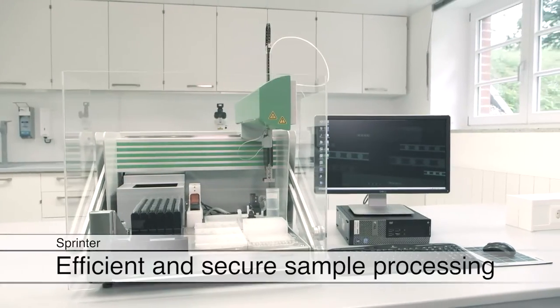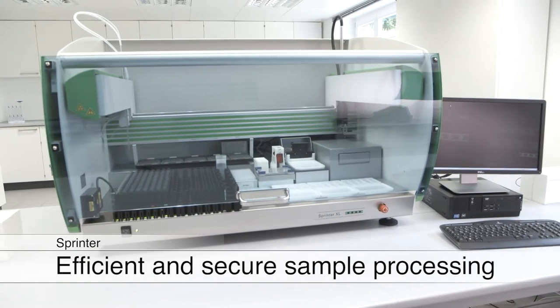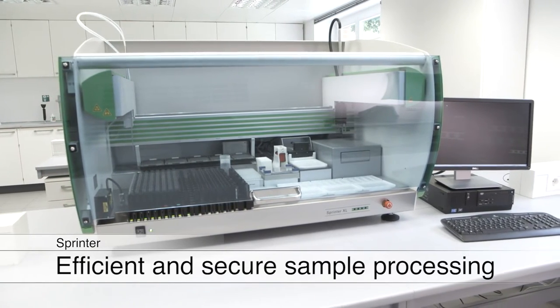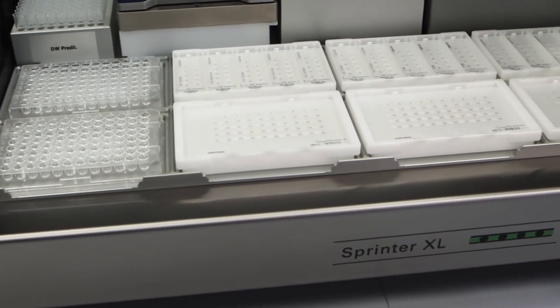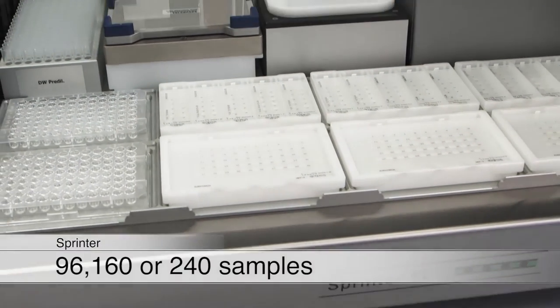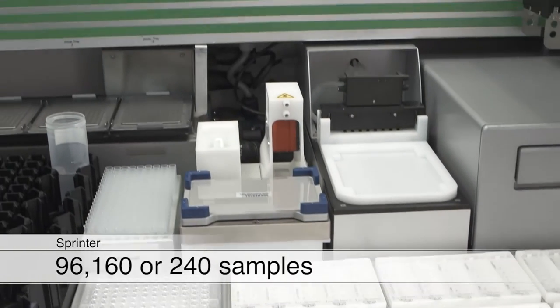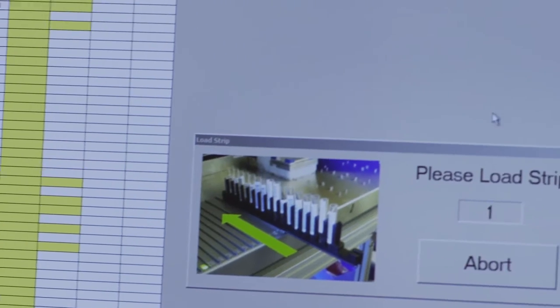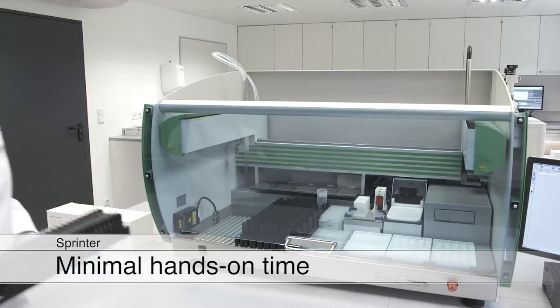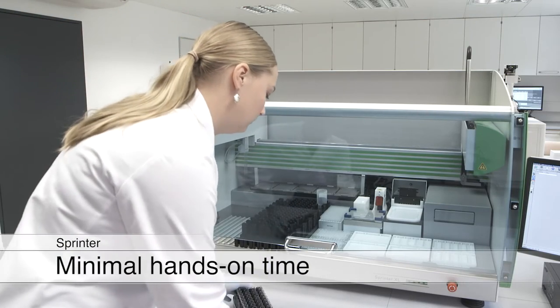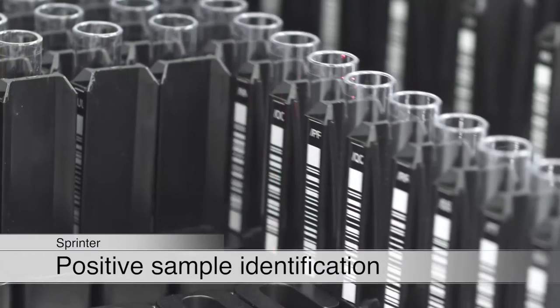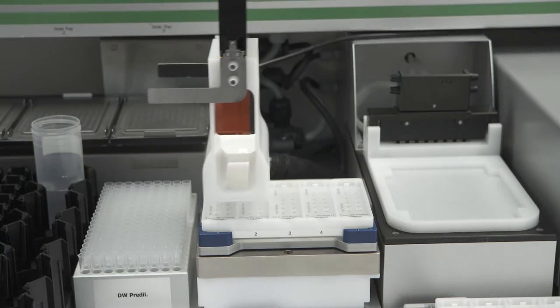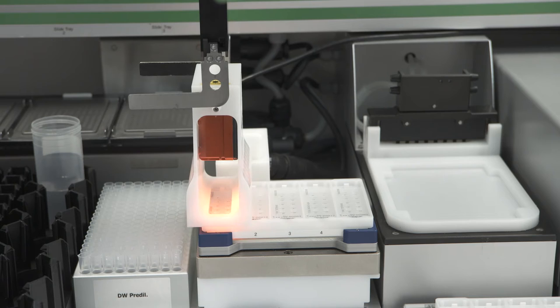The IF Sprinter and Sprinter XL are efficient and reliable systems for the automated processing of immunofluorescence tests. They can process 96, 160 or 240 samples in one run. Software handling and loading of the instruments is very easy and only requires minimal hands-on time. The samples are clearly identified by their barcodes. For complete traceability of patient results, the object slides are also automatically identified.